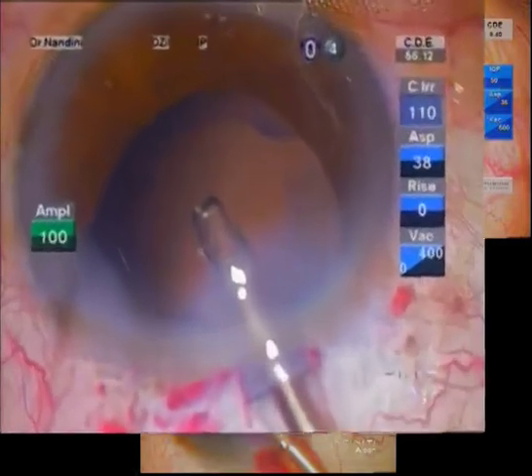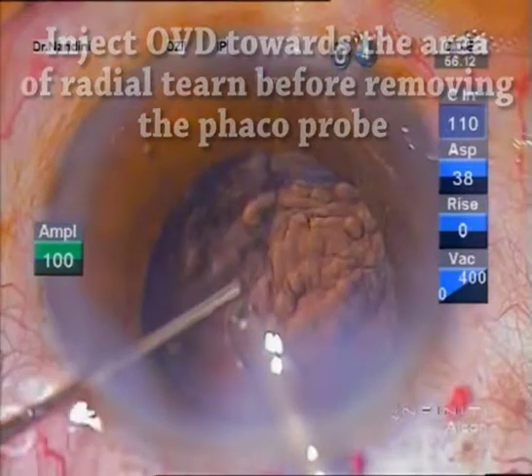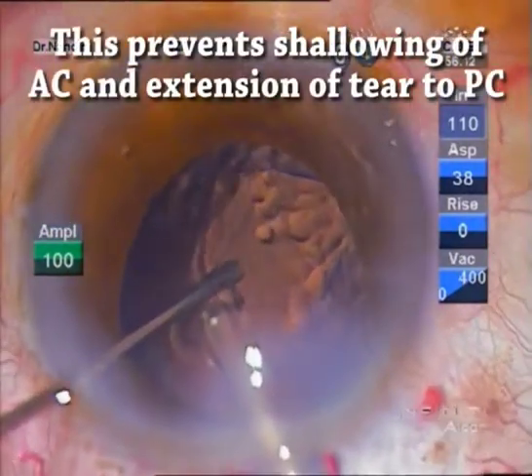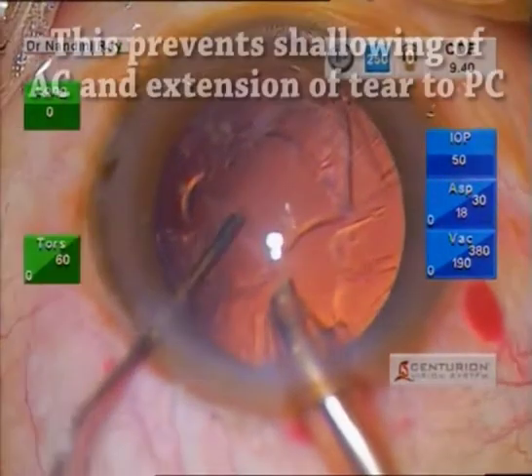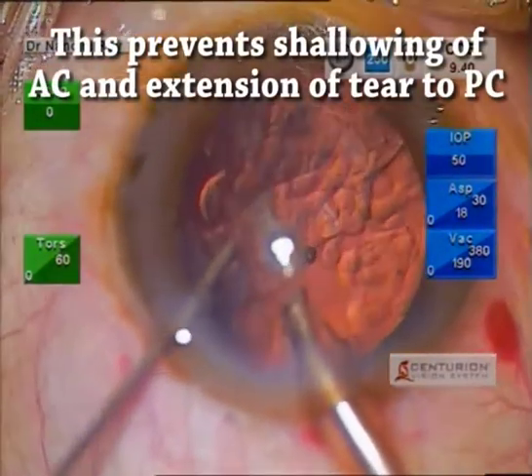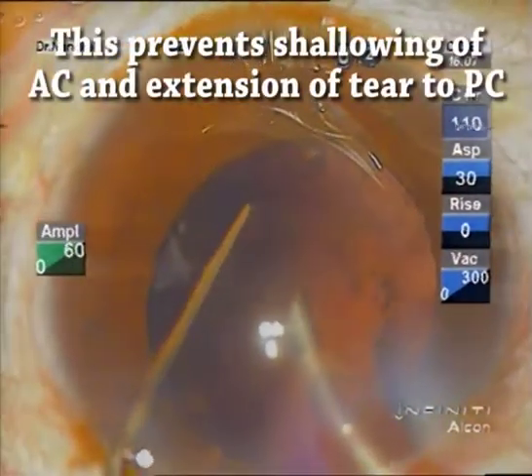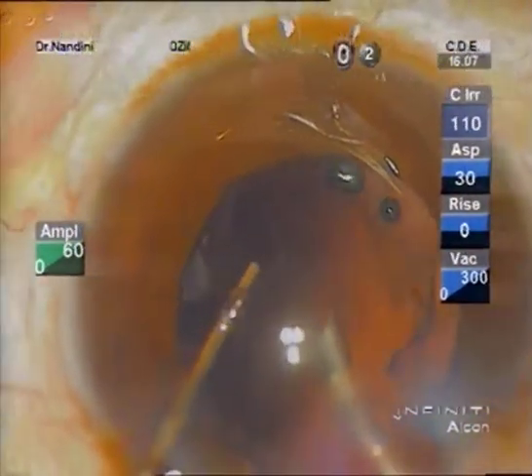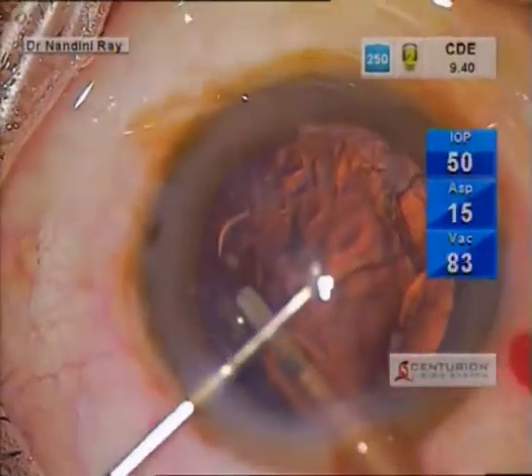As a golden rule, removal of the phacoprobe immediately is an absolute contraindication. One must immediately inject OVD into the area of the radial tear so as to prevent extension or involvement of the posterior capsule or even extension to the periphery before removing the phacoprobe.